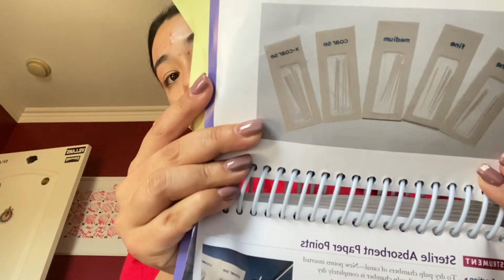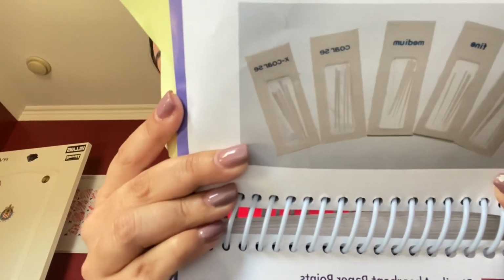They actually are the shape of gutta percha, so they absorb the water in the canal well. And these are what paper points look like. They're just tightly rolled up, like cotton points. And like I said, they're almost the shape of the canal, so it just helps the doctor go ahead in there and dry them.